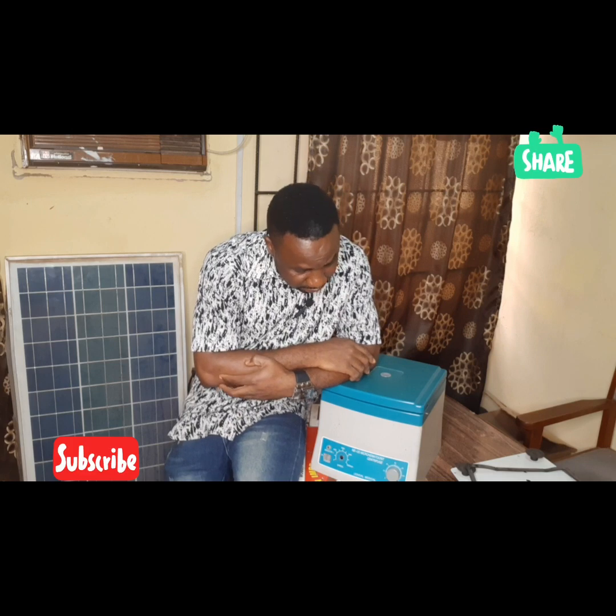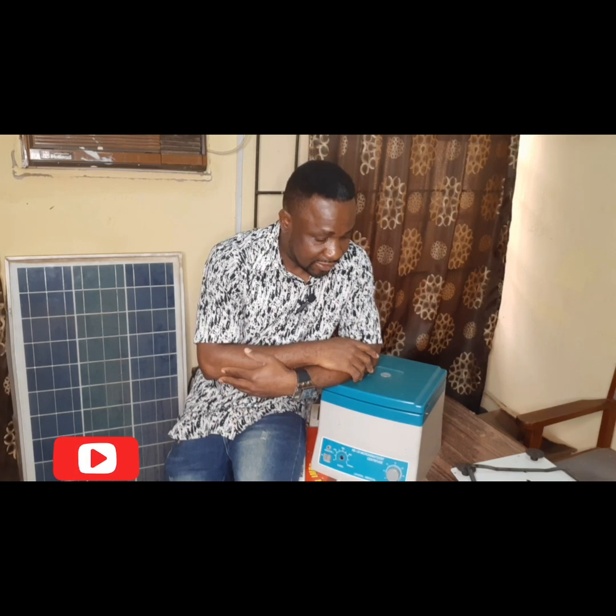We are going to be looking at a pragmatic diagnosis of this faulty hematocrit centrifuge. I am going to be walking you through the repairs. We are going to look at it step by step to see how we can resolve what the problem is. Presently, this machine doesn't come on, so we are going to look at it, find out what the fault may be, and probably resolve it.